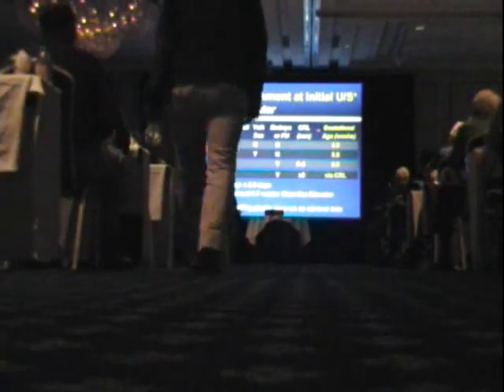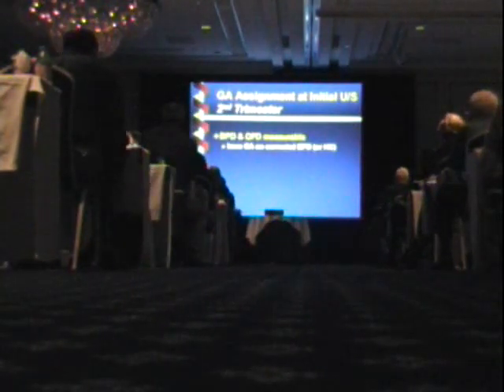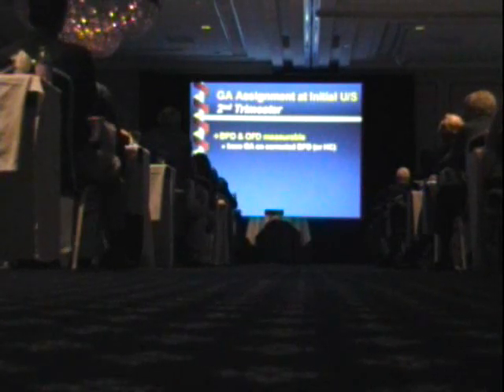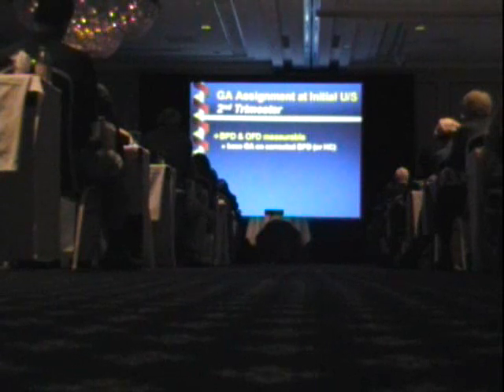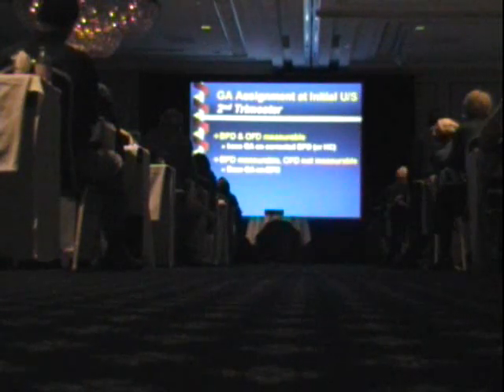We know that it's 8.5 weeks because 3 weeks ago it was 5.5 weeks. Come the second trimester, if the initial scan is in the second trimester, then we date pregnancies very differently than in the first trimester. If the biparietal diameter and occipital-frontal diameter, the side-to-side and front-to-back measurements, are both measurable, we base the gestational age on what we call the corrected biparietal diameter, which is equivalent to the head circumference. We'll see in a minute what that is.